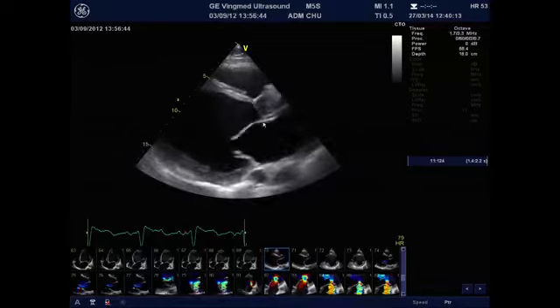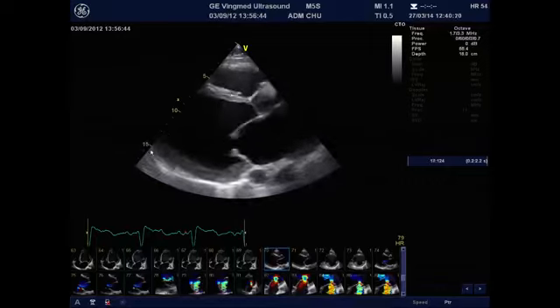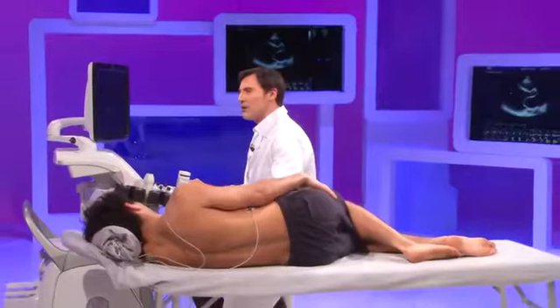here you have the morphology of the valve that is completely deformed due to the attraction by the papillary muscles that are here displaced and distorted due to the left ventricular dilatation. And again, this kind of mitral regurg relates to two different things: an increase in tethering force and a decrease in mitral closing force.